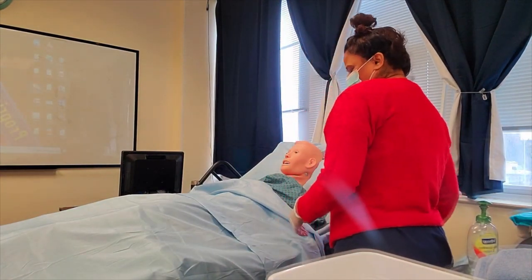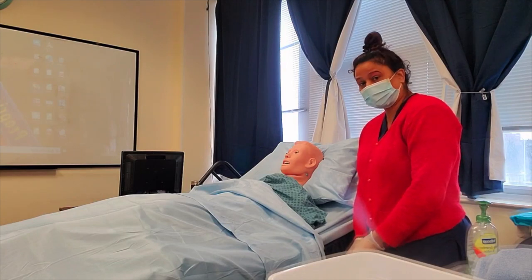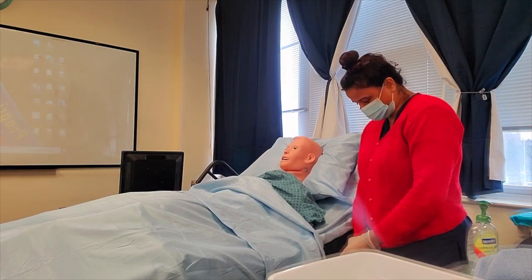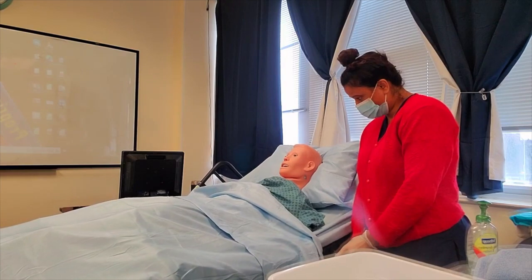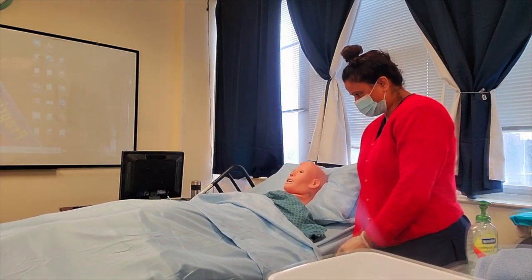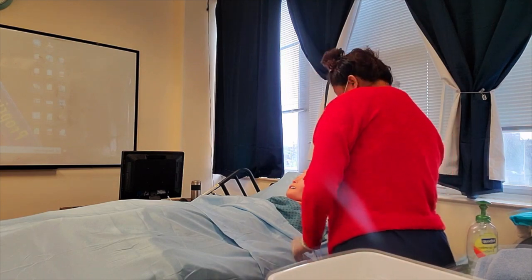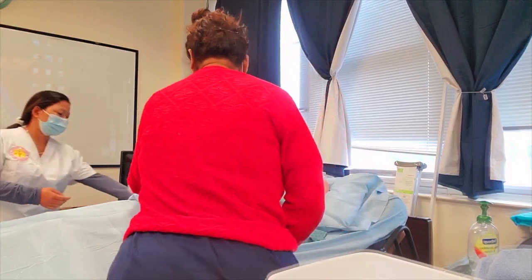If I have to turn my patient on the side, the head of the bed has to be low — because you don't want to turn her when the head is too high. Make sure you use proper body mechanics.